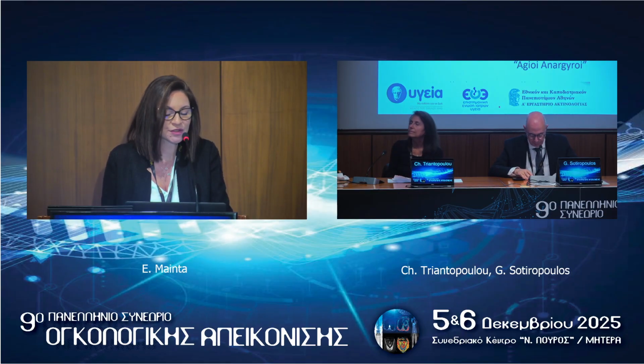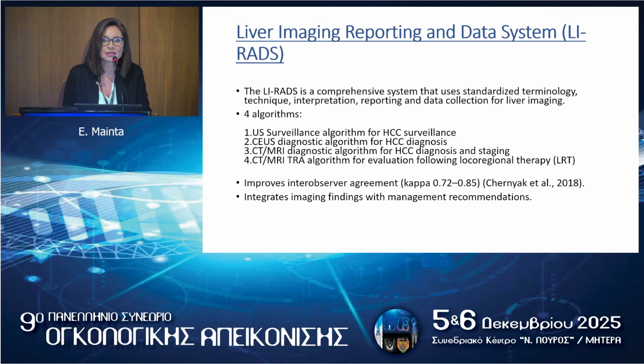So today's lecture is going to be on LI-RADS, which is a comprehensive system that standardizes terminology, technique, interpretation, reporting and data collection for liver imaging.